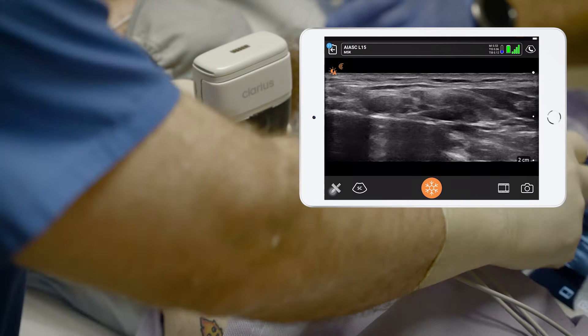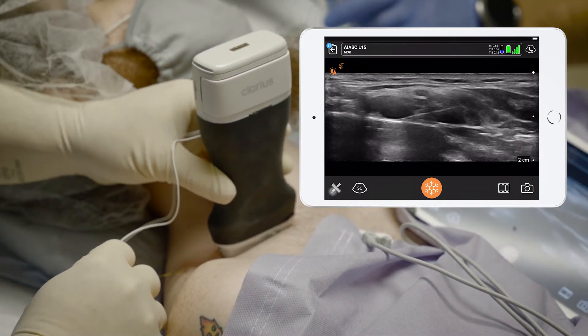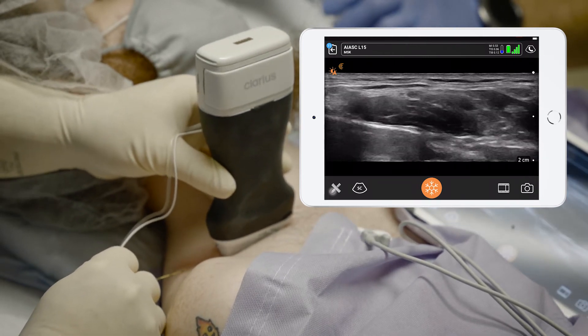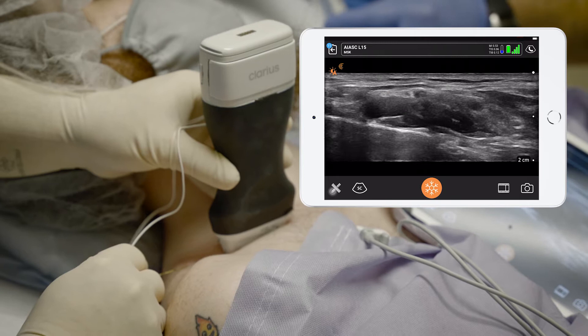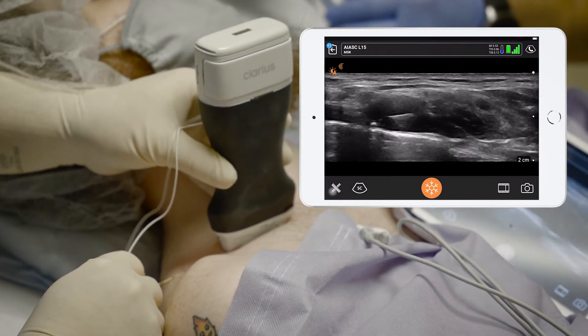Aspiration's negative there. Injecting one, two — beautiful — three, four. Pull back a little bit. I'm going to go in a little farther, get right under the artery. See the artery there. Give me five more.